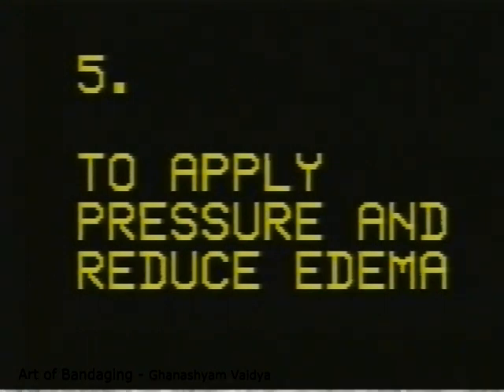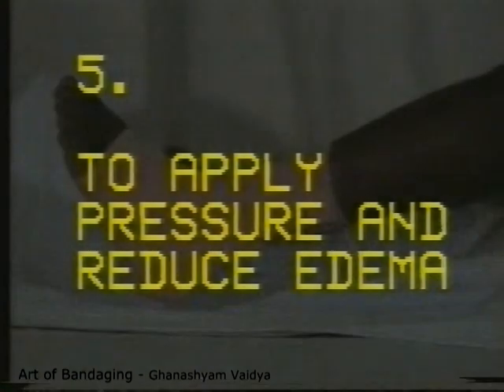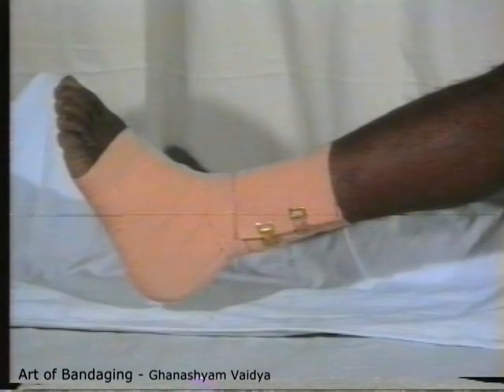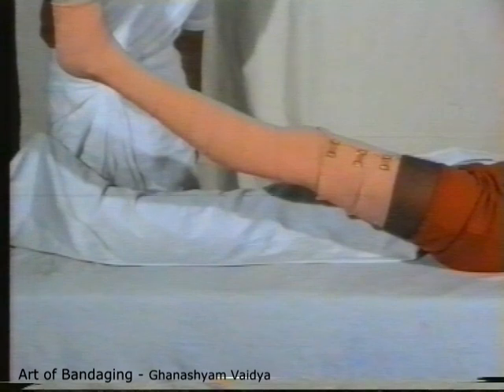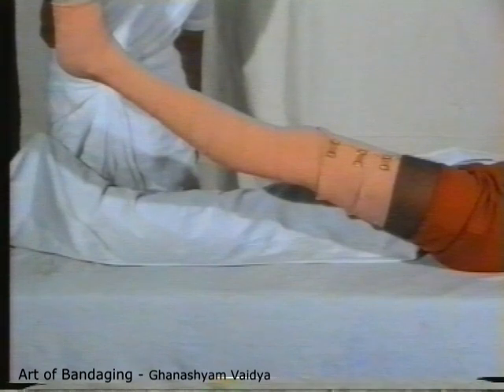A tight bandage over a limb is often used to control hemorrhage. See this bleeding surface over the left thigh and note how a tight bandage is given, rolled tightly to control the bleeding. An elastic bandage is used to apply pressure and reduce edema, as this ankle bandage for ankle sprain. It is also used in varicose veins to improve venous return and prevent edema of the foot.